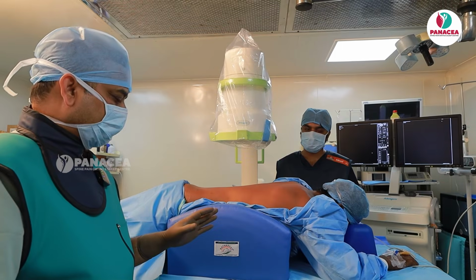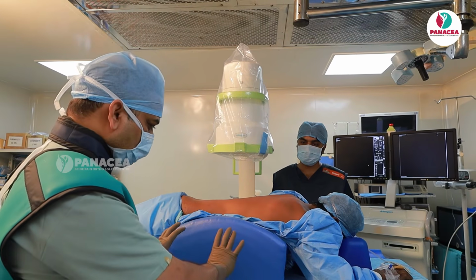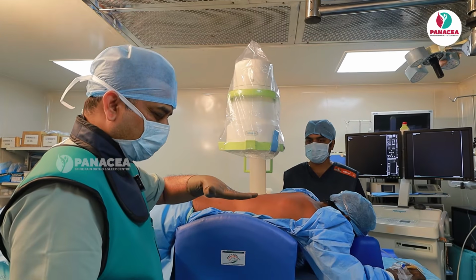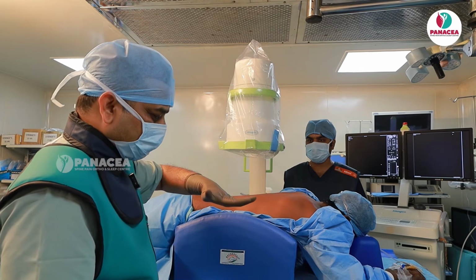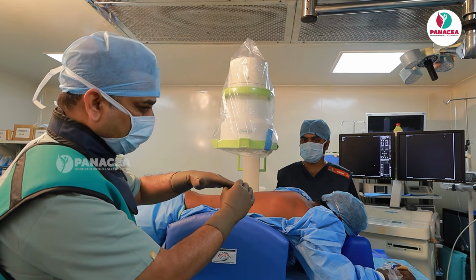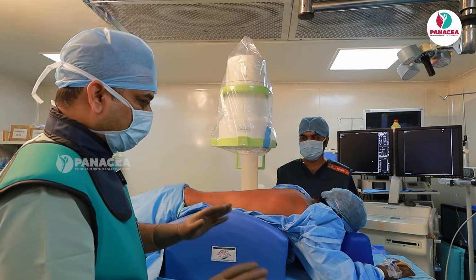So if you see the position here, the patient is positioned prone on a pillow, any pillow, no issue, but it almost looks like a Wilson frame. It's a soft cushion pillow, because definitely the lumbar spine has got some lordosis. So by putting this cushion under the abdomen, we are trying to reduce and obliterate the lordosis, or we are making a little kyphosis, so that you don't require too much wigwagging of the C-arm. That is an advantage, and the patient is conscious.